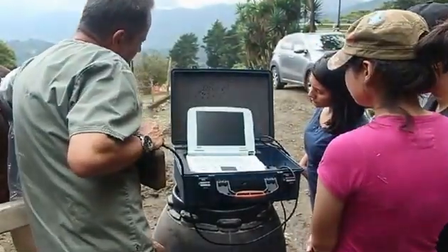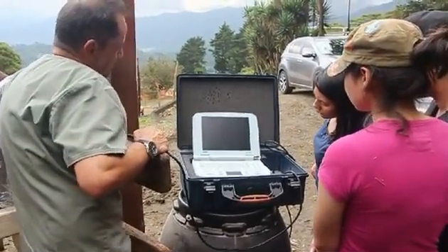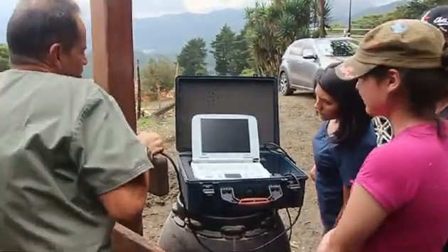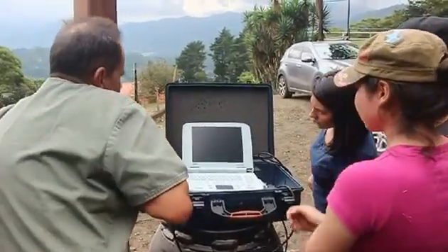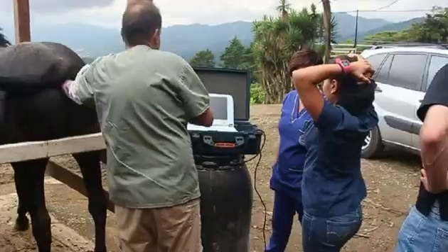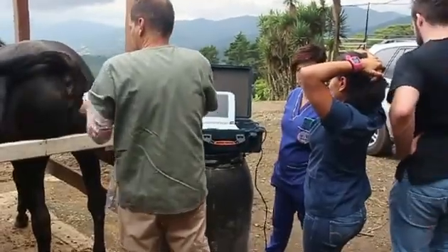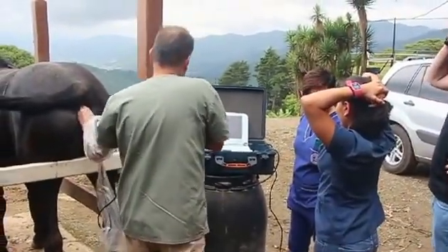Here are all the students trying to learn something. It is very hard to look at that picture — to me it looks like spaghetti — but the doctor has experience and he is showing them what pieces he's looking at. This one here is a different horse: this is Pirouette, and she's also about eight months pregnant.